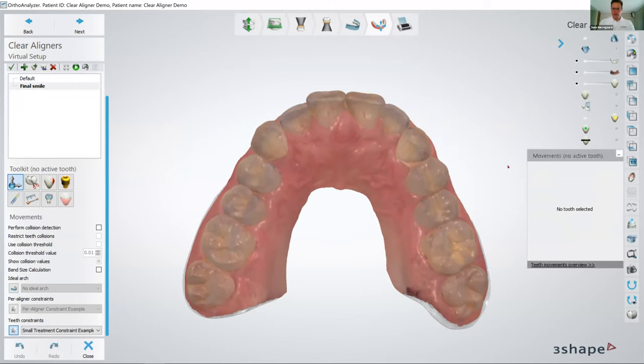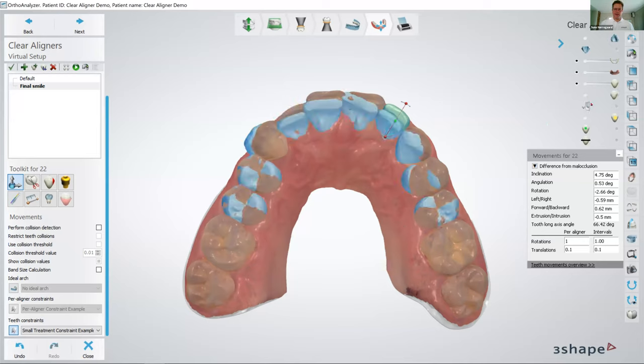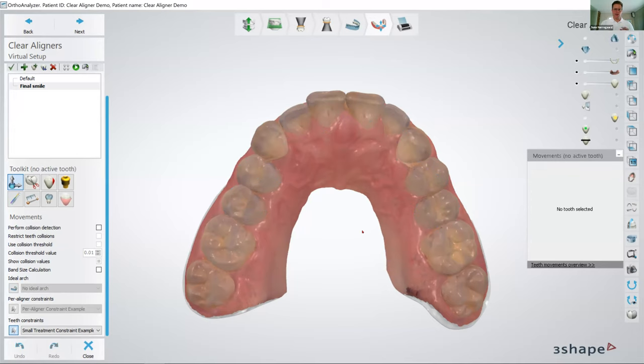Other additional tools that we have is that we can mirror a tooth, meaning that if I select a tooth, then I can see it mirrored on the other side. And that can also help me to really fine tune the detail on whether it is exactly in the same position, and that helps me to create the symmetry for the case. And you can also activate the original position and compare it with the new one. So when you do your planning and your treatment, you do have a lot of options to see before and after.